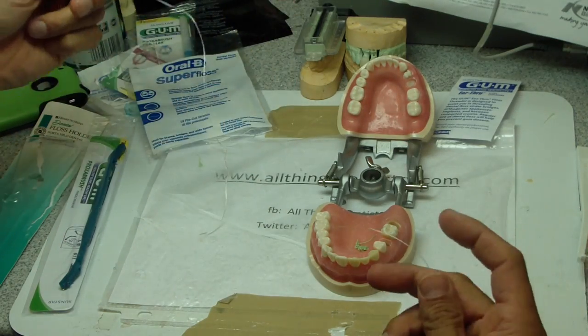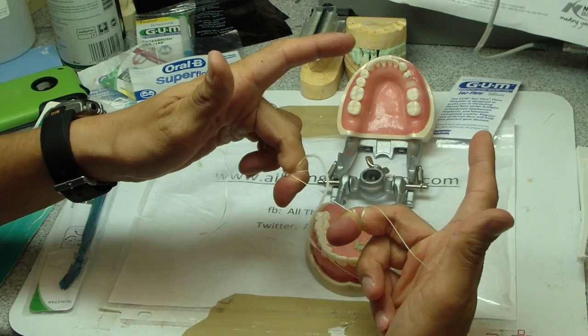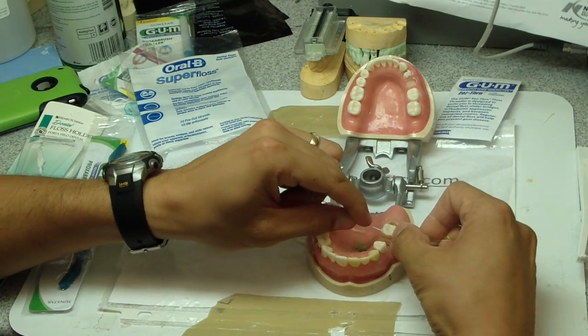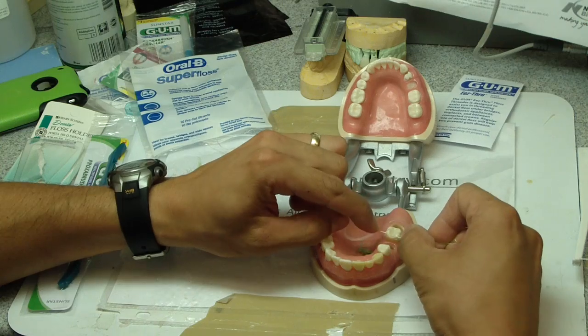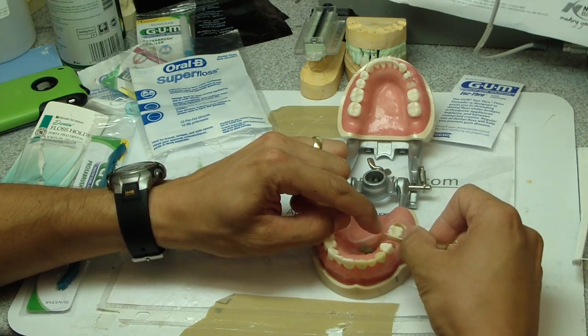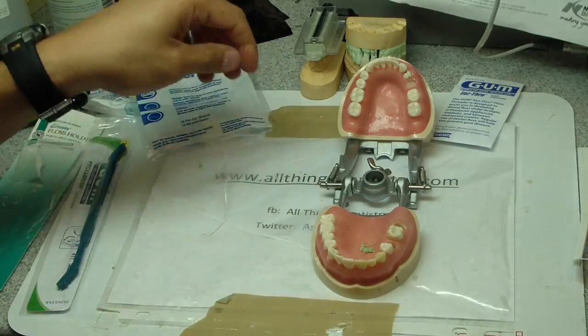And then to make things really easy, there's just floss at the end of super floss. So you can wrap it around the middle fingers and then floss your other teeth up and down through where the teeth connect. Let's keep going — I want this video to be short.